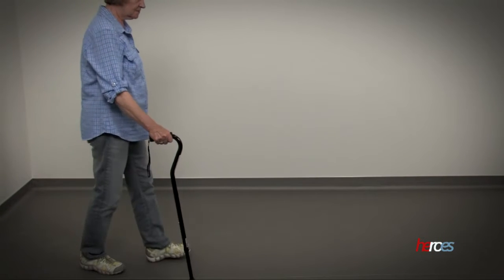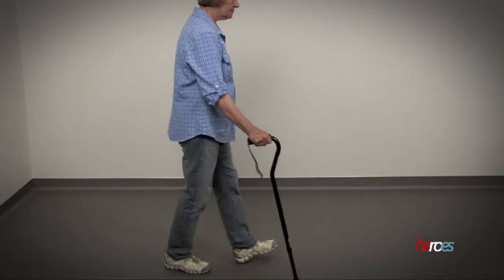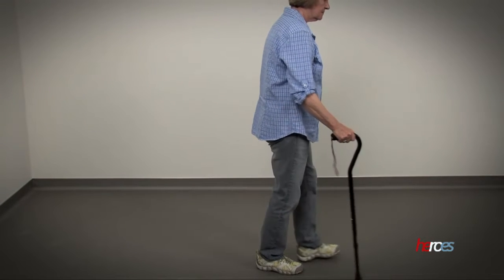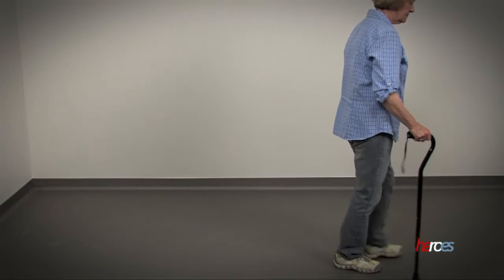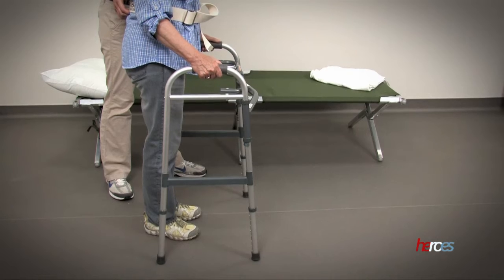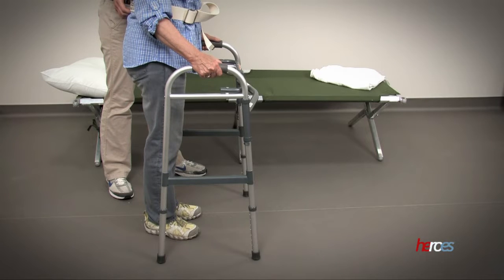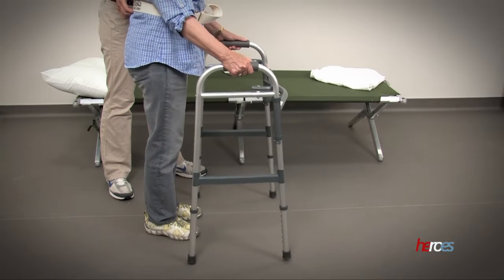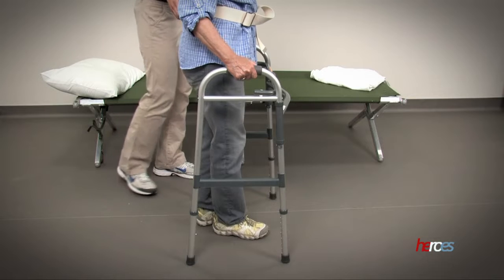There may be individuals at the shelter who previously used an assistive device but left their homes without it during the disaster. Some individuals may exhibit unsteadiness with standing and walking, indicating that they may benefit from an assistive device.